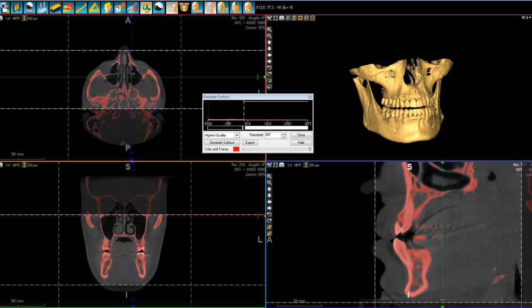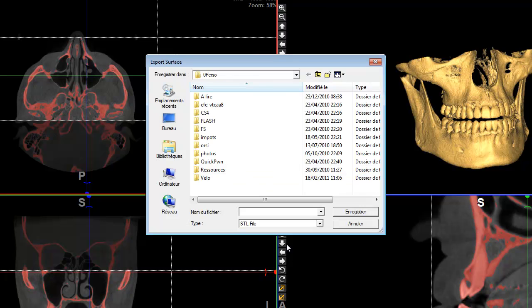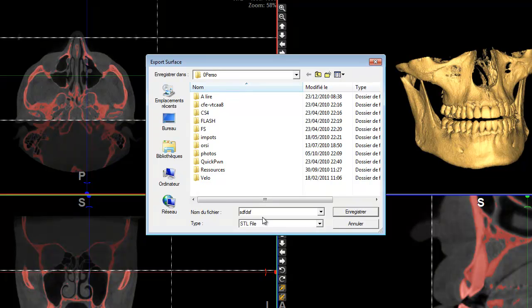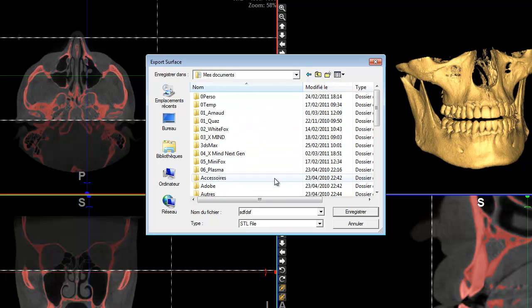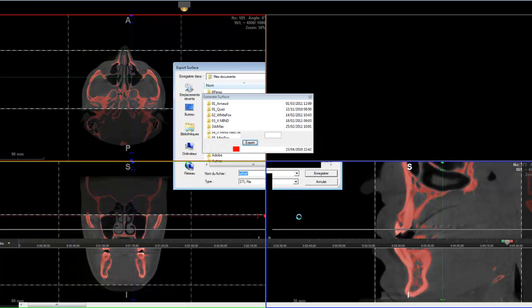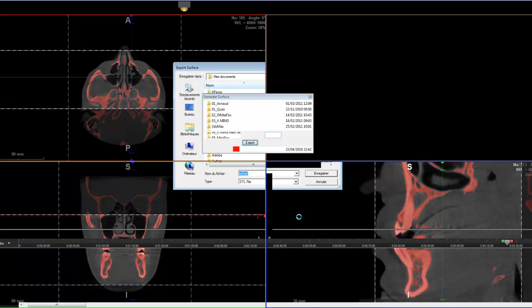Once you have done that, you click on Export. You can see the .stl file here — simply put a name, select the folder where you want to save it, and click Store, and that will be it. This process demands a lot of processor capacity, but in general you get it.